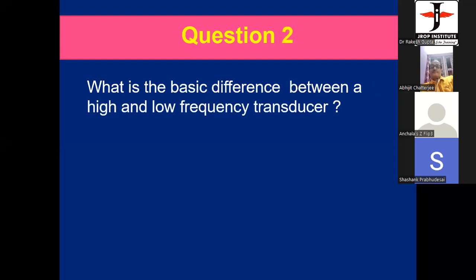What is the difference between high and low frequency transducers? Sir, low frequency transducer is for the deeper structures.